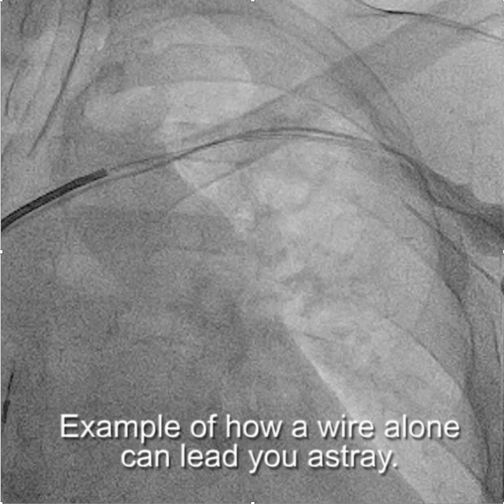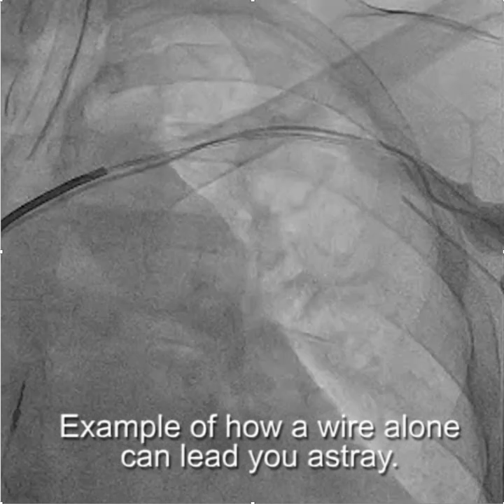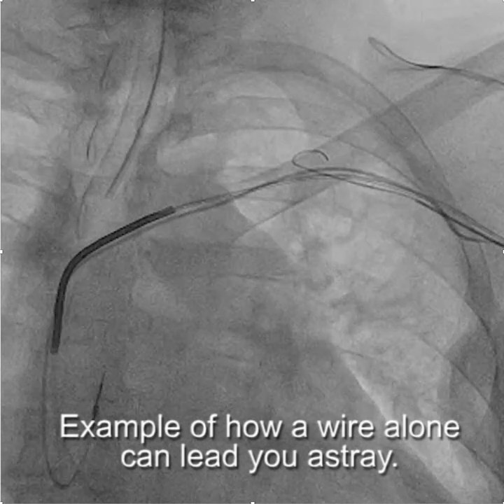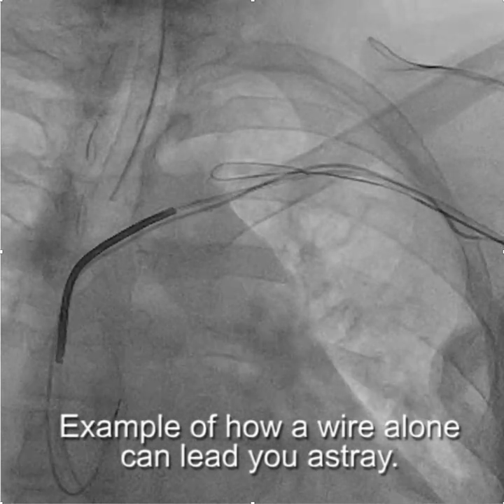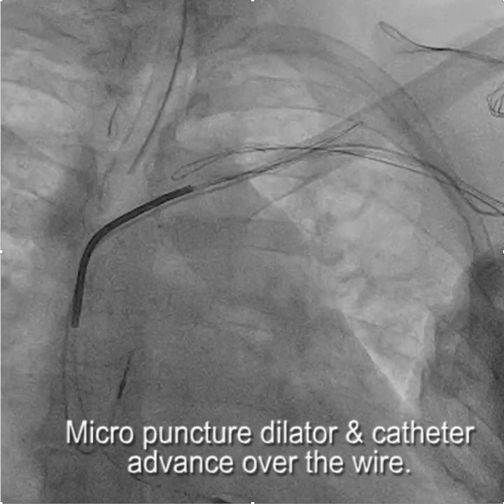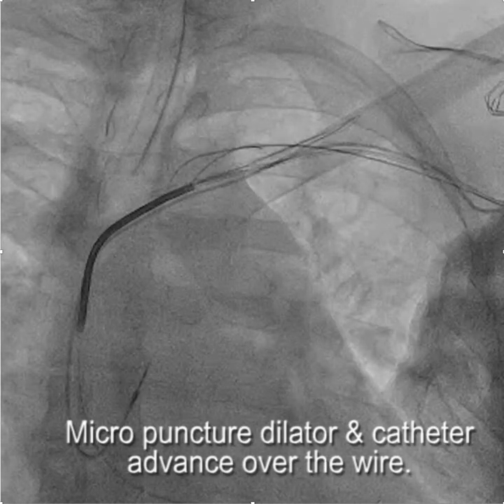When trying to obtain access, where the wire goes can sometimes lead you astray in terms of whether you can get through an occlusion. Here, this looks like a relatively benign venogram. We get access with a micropuncture setup and advance the wire, but the wire stops dead. We push on the wire and nothing happens.